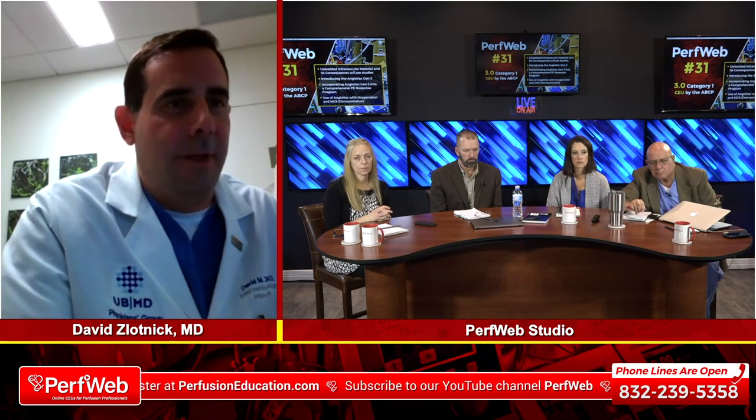And it's going to be imperative on people like myself to get our data out there to show that we can successfully treat these patients with this. We can take patients from surgery, treat them medically, have just as good outcomes, and potentially avoid the adverse outcomes later on of a prosthetic device infection. That's going to change practice, but it's not going to happen overnight. So those are the barriers. Yeah, and reducing the risk of sternotomy.